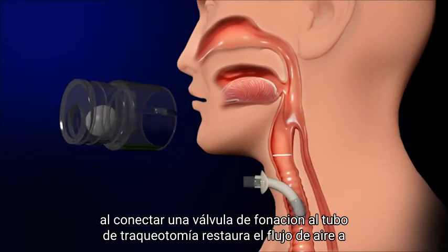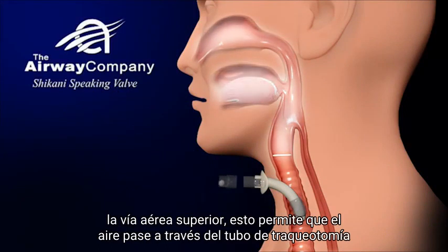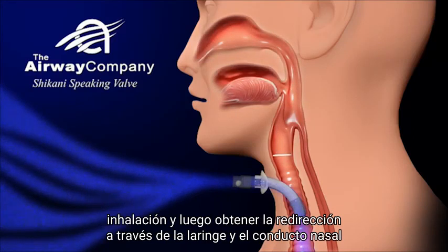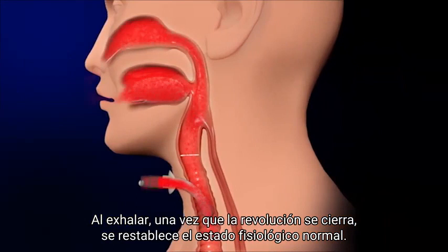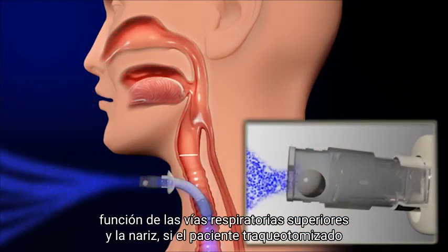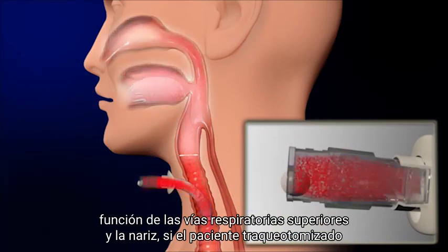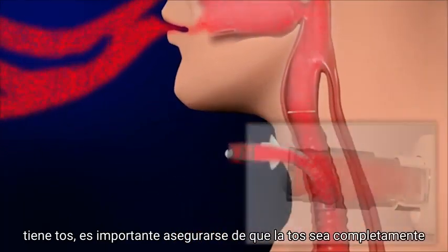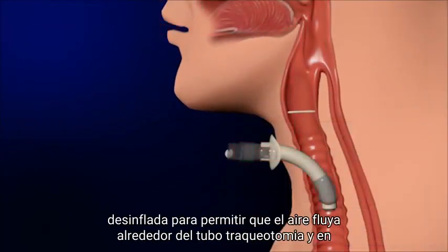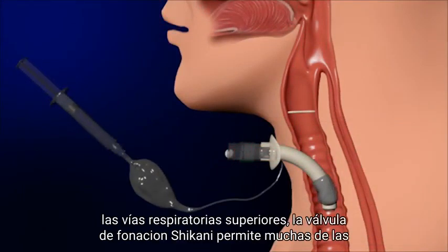Attaching a speaking valve to the tracheotomy tube restores airflow to the upper airway. This allows air to pass through the tracheotomy tube upon inhalation and then get redirected through the larynx and the nasal passage upon exhalation once the valve closes, restoring the normal physiologic function of the upper airway and the nose. If the tracheotomy tube happens to have a cuff, it is important to make sure that the cuff is completely deflated, to allow airflow around the tracheotomy tube and into the upper airway.